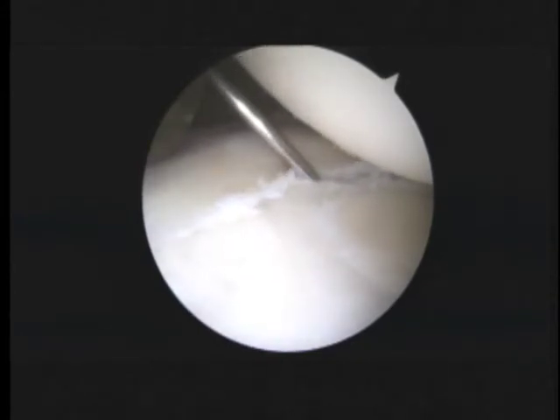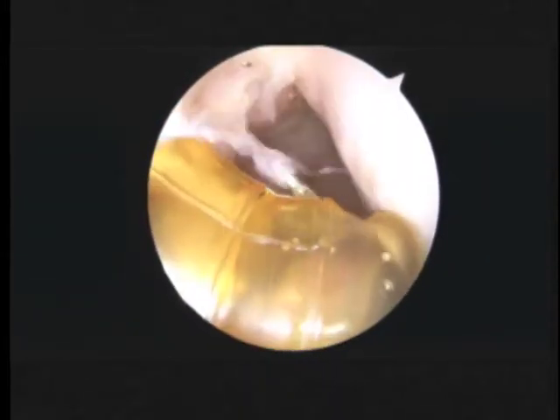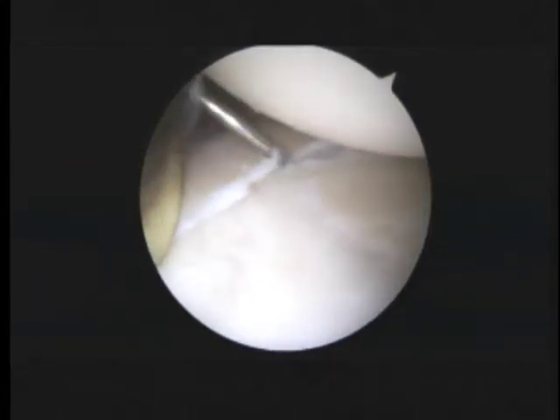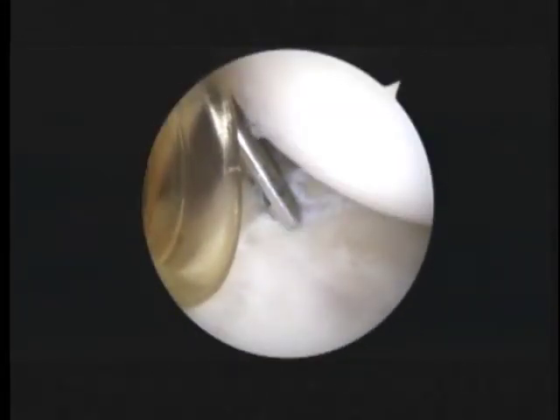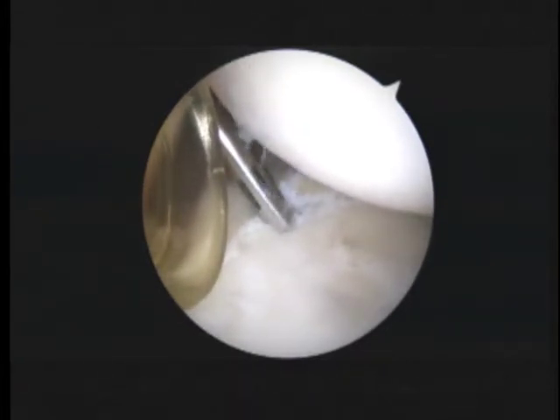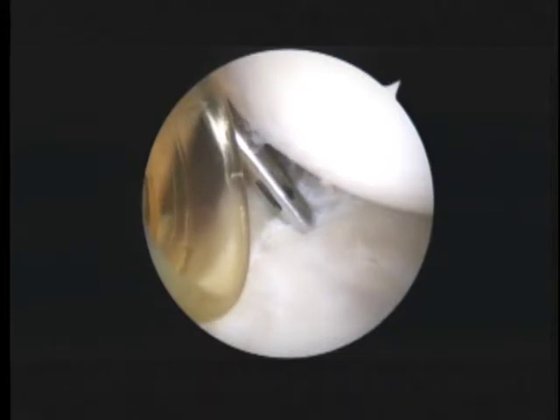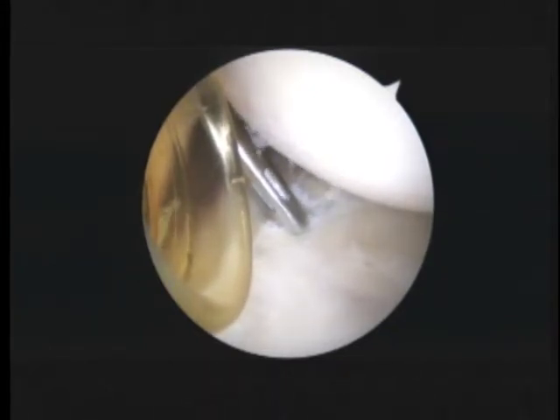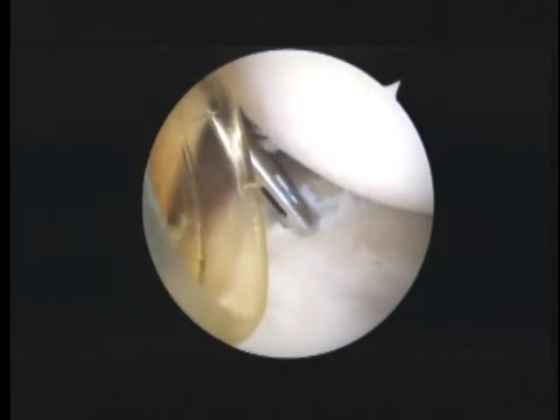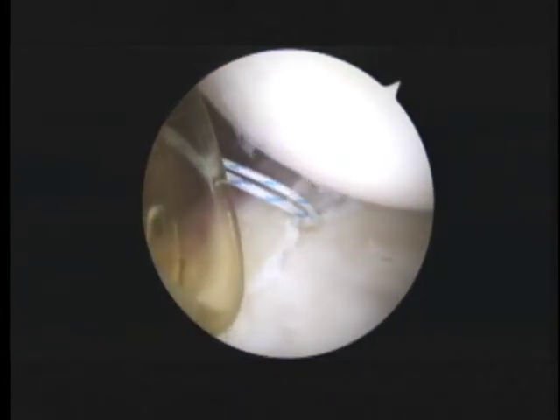You can see we're going to try and place our anchor down right about here at this angle. We're coming through a percutaneous approach, meaning we're not coming through that yellow cannula that you see — we're coming through right here. You can see our drill guide in position. After we take that down into the bone, we then place our suture anchor. Sometimes you can see it going down through the little windows there — there it is, going down. Then we just tap that with a hammer, basically. And that gives us those two sutures to work with.